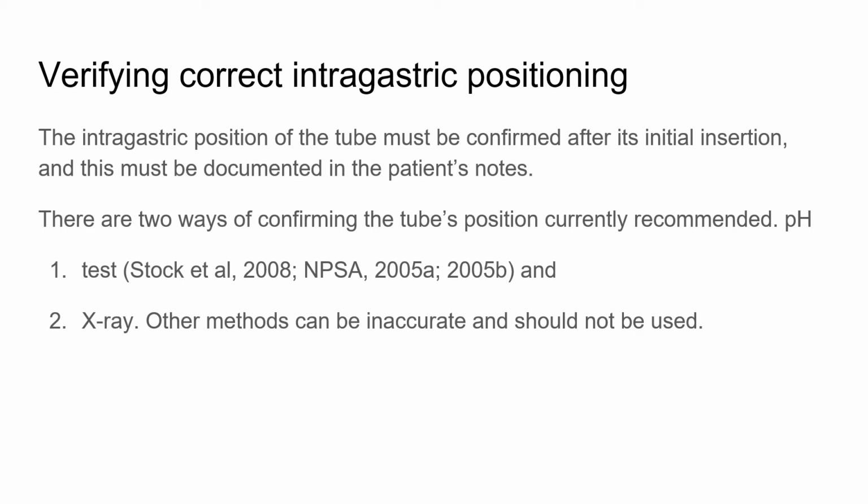So there are two methods usually recommended. One is the pH test, that is the aspiration, so we'll see what has to be done in the pH test, as well as the X-ray. Other methods can be inaccurate and should not be used. So this is what is recommended. Either you go for a pH test or go for an X-ray to confirm.